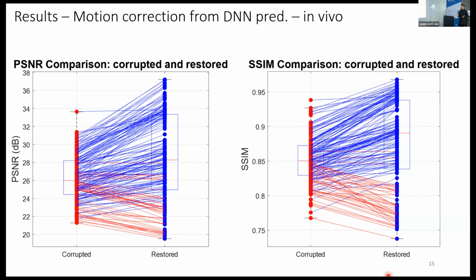It's in vivo, but as the second step after acquisitions of each of the Shoko protocol, we always perform a motion-free scan where the patient stays still, and subsequently they produce the different motion patterns. So we have these reference motionless scans that we can use as a sort of weak reference. And we see that even like that, it's correct.